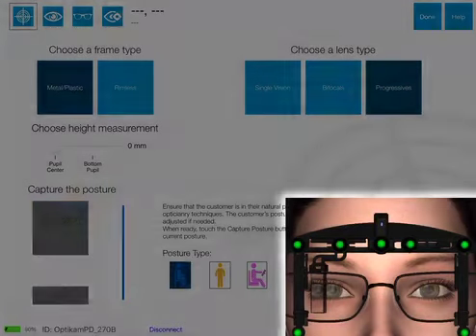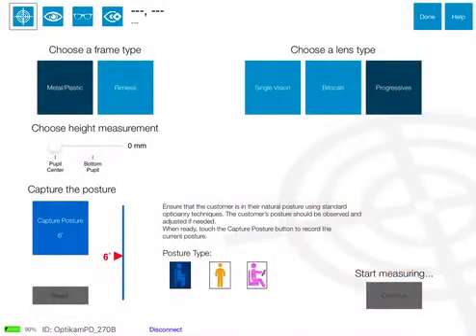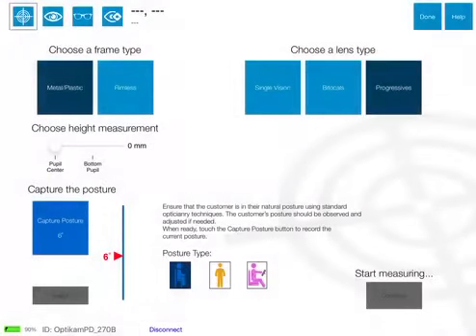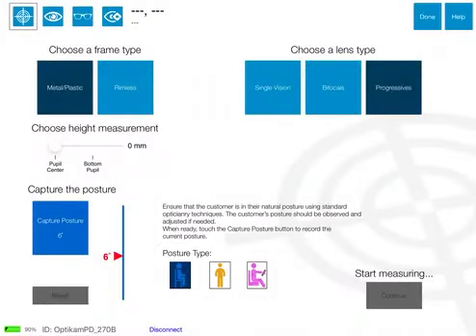The OPD indicator light will quickly blink green 4 times to confirm that you are connected to the correct device. If it does not, you may have connected to another OPD in the store, in which case you can tap Disconnect to try again. Select either the sitting, standing, or driving posture type based on the posture that you'll be measuring the customer in. In most cases, opticians tend to measure the sitting posture.